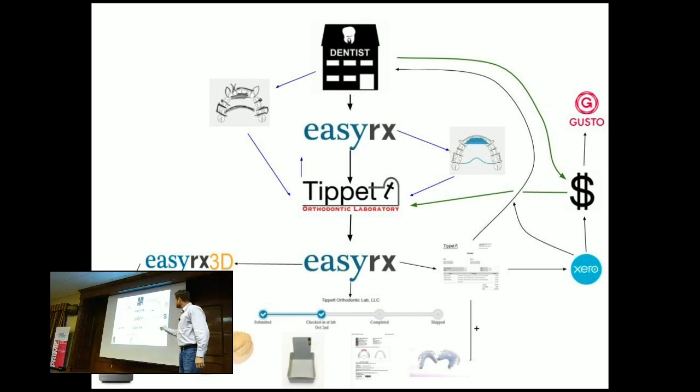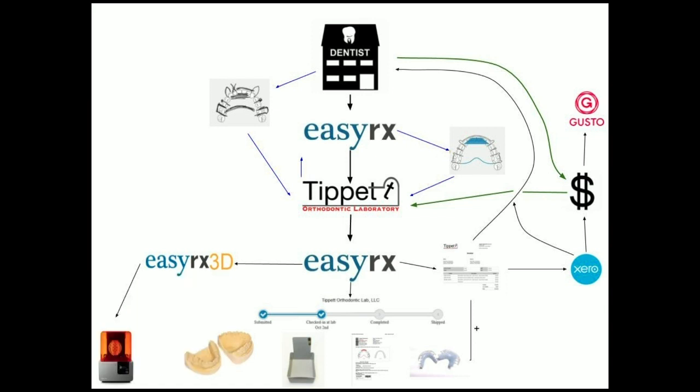So we're back to this. So dentist, so as you can see, I put this here. This is a hand drawn script that he sends to my lab, and I upload it back to EasyRx and produce this from it, back to here, back to there. So it provides two routes, and we'll talk about those. One digital and then one classic without causing too much disturbance. But it's all contained, as you can see, EasyRx bookends my lab. And so we're in there together.